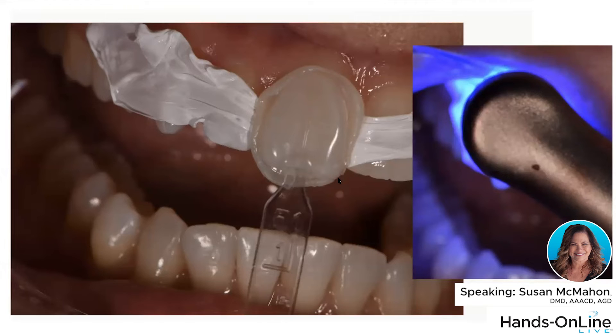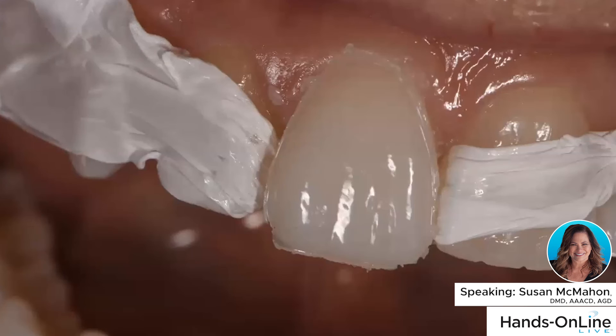When you load the template, load up a little bit more than flat — when you look at the template from the side you should see just a small mound on it, because you don't want any voids and you want that extra material when you place it. Then take an instrument and push toward the tooth — don't pull away. Hold the template on, push toward the tooth, get all the excess away, then cure right through the template. You'll see how the beautiful anatomy is already built in.